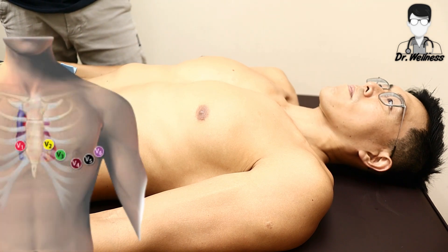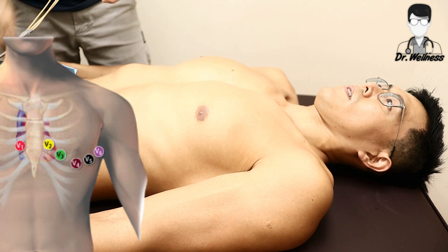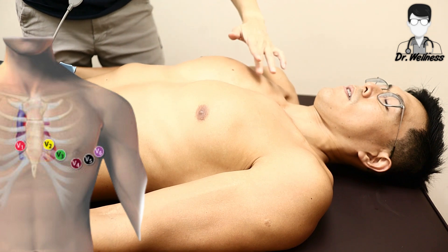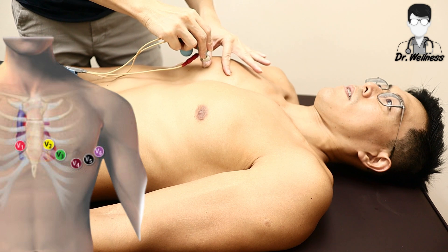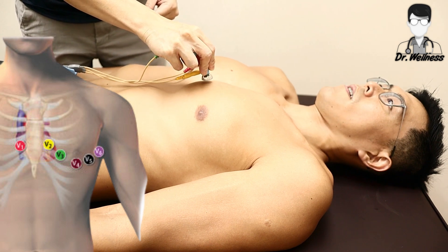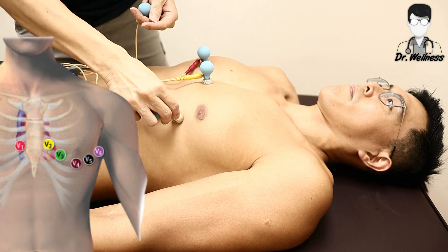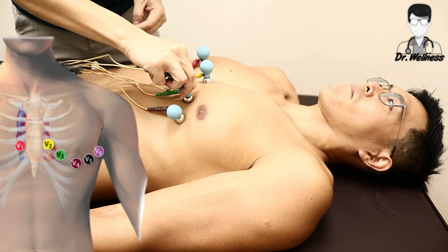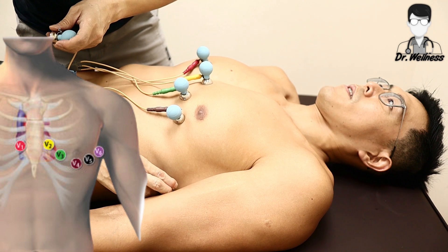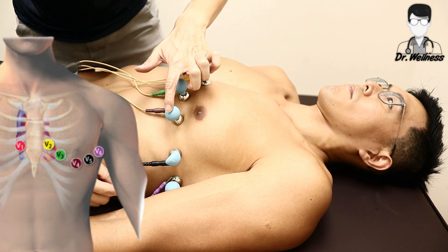The chest leads are V1, V2, V3, V4, V5, and V6. V1 will be on the right of the patient, on the fourth intercostal space to the right of the sternum. V2 lead will be on the fourth intercostal space to the left of the sternum. Following which, we will hook up V4, which is just under the nipple. V3 will be between V2 and V4. V6 will be along the mid-axillary line, on the same level as V4. And V5 will be in between V4 and V6.